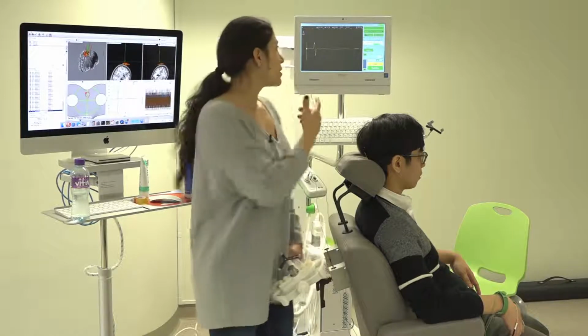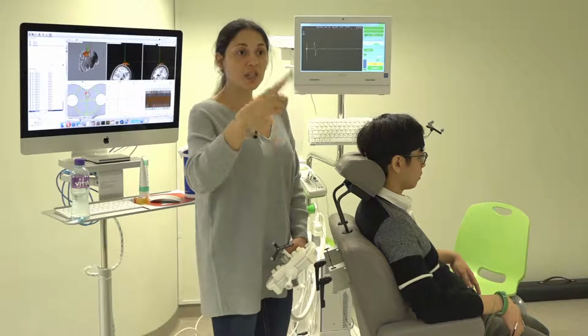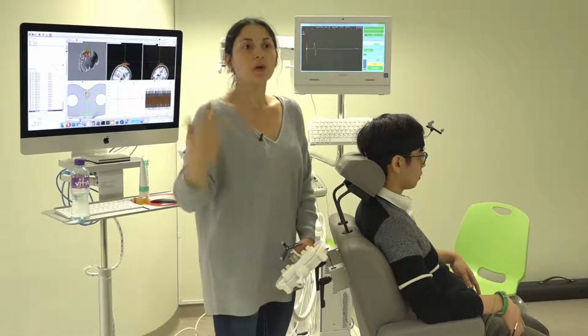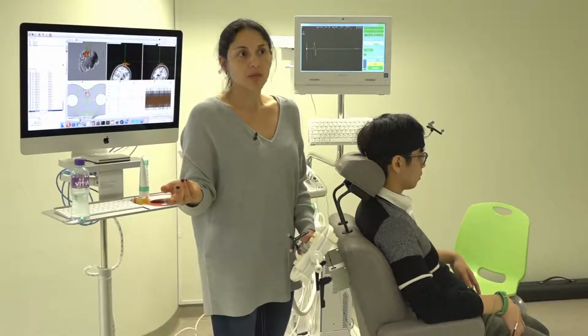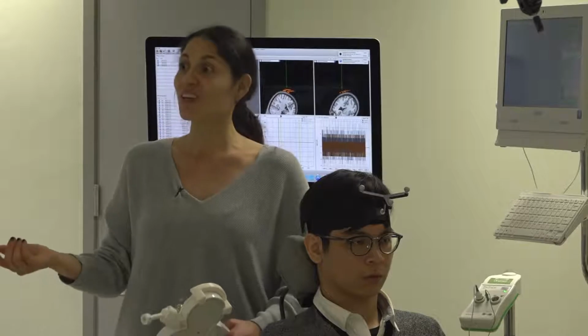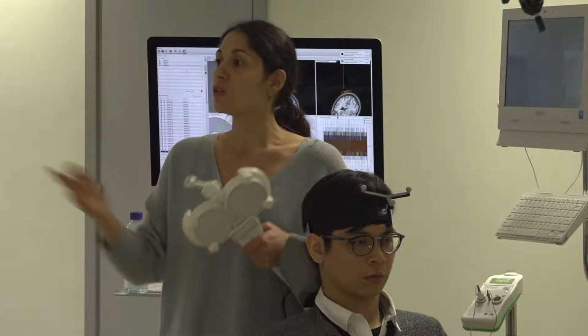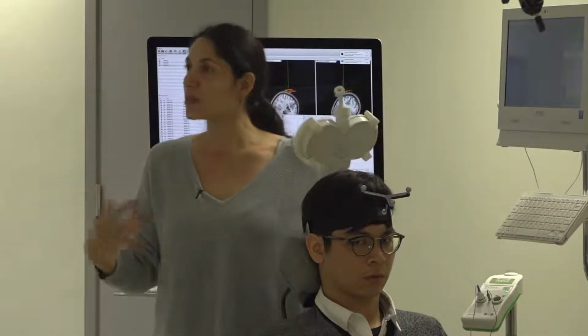So you don't want the subject to be able to see the screen. He could see the screen at that moment, so he could really do it high or low. He has to be discarded from the study, of course, because that would not work, right? So what do you need, high or low? I need you to not do anything, right? So that's important. Anyone wants to try? Please, you need to test.